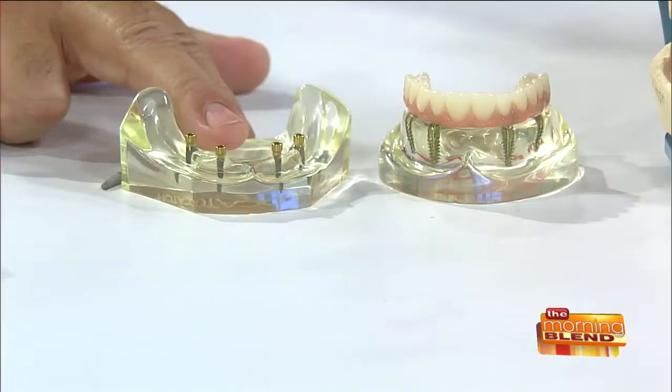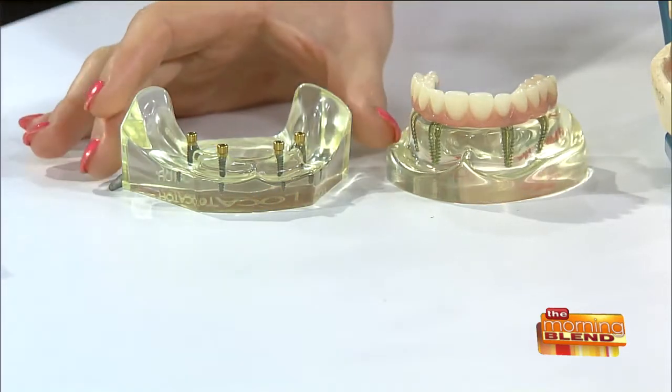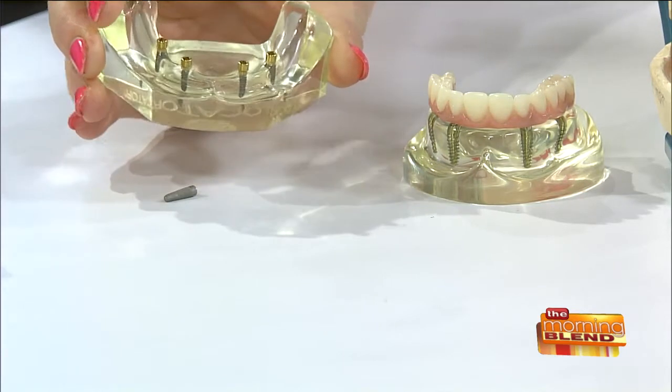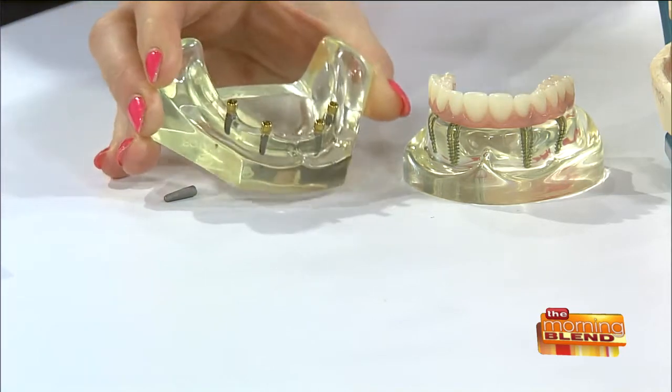Yeah. So we do have systems, for example. We have a mini dental implant system, if we look here at the desk, where we could place mini implants. So people can see it. They're basically mini implants that we could place in the jawbone. And then what patients actually do, instead of using the adhesive, is snap their dentures into place. Oh, okay.